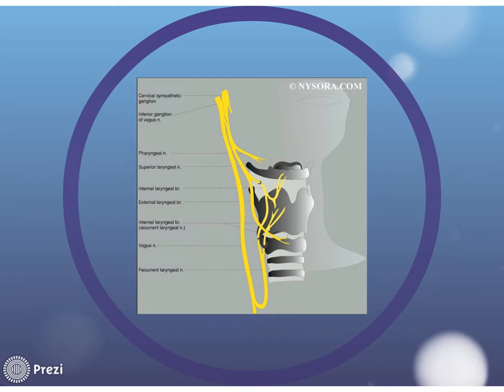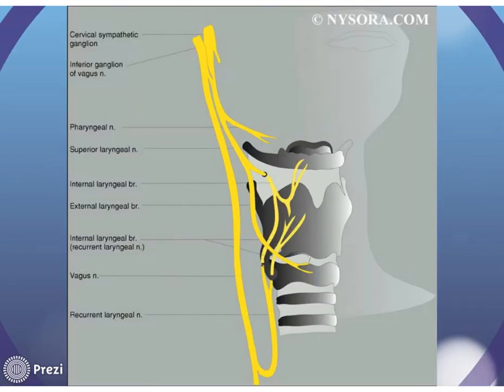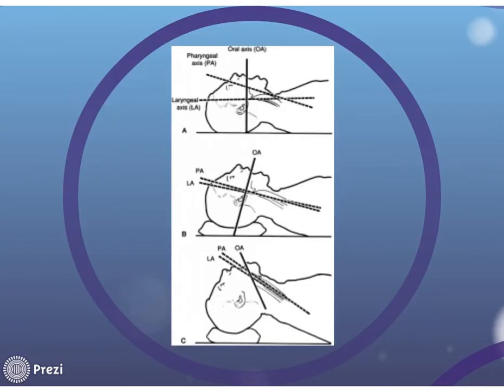And here are the axes that I was talking about. We've got the oral axis, the pharyngeal axis, and the laryngeal axis. So this is when you've hyperextended the head too much, so the axes don't align. Here you see they're intersected. That's where you're going to get your best view. And here you can see they're not quite intersected yet. So what they did was they lifted the head.